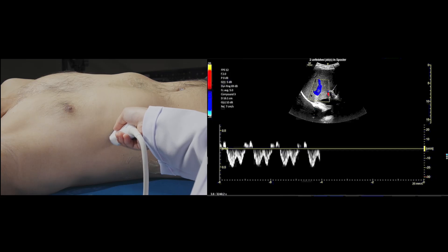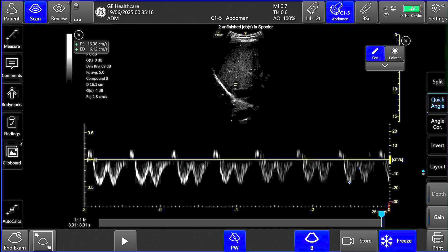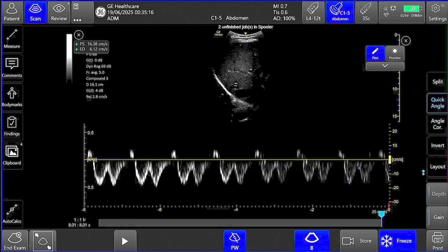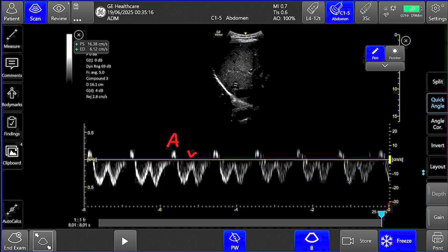Next, we put the pulsed-wave Doppler on and place the sample volume within the hepatic vein, at least 1 to 2 centimeters away from the junction of the hepatic vein and IVC. You can sample any of the three hepatic veins based on ease of access. You can ask the patient to hold their breath slightly at end-expiration. The hepatic vein waveform has two positive retrograde waves — A and V — and two negative antegrade waves — S and D.